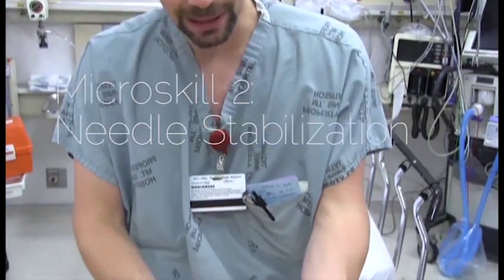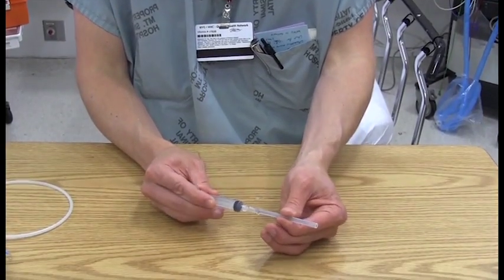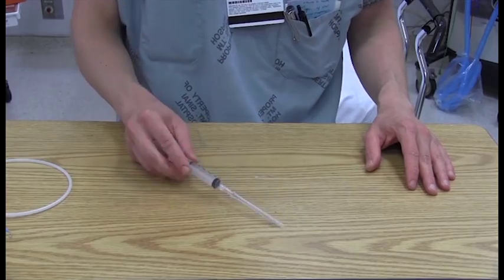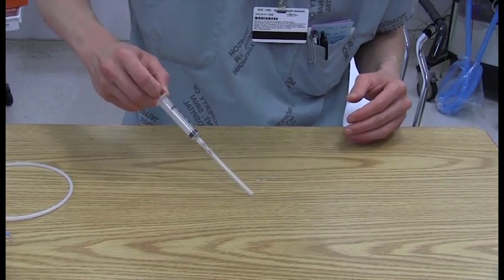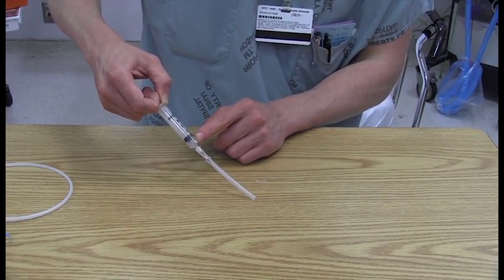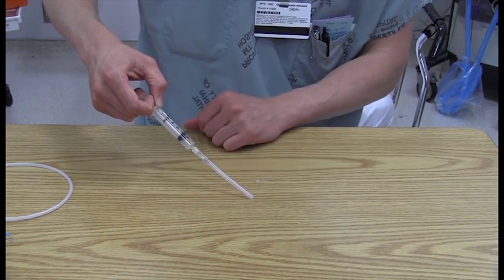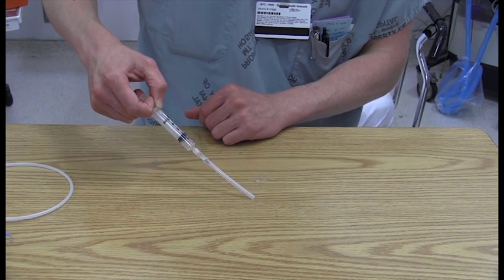And I'm just going to put on this cover because it doesn't affect anything and it'll keep me from sticking myself. But if you don't want to put it on for true realism, that's fine. And this micro skill is you're at the point where you've already entered the skin and you've gotten your first flashback into your hub. Now what you need to do is disconnect the syringe from the needle and put a wire in.